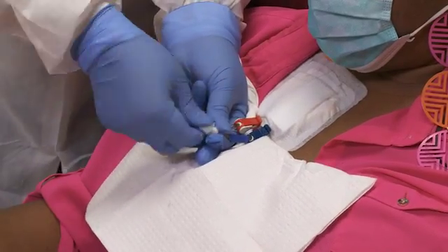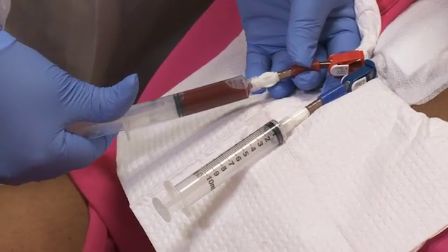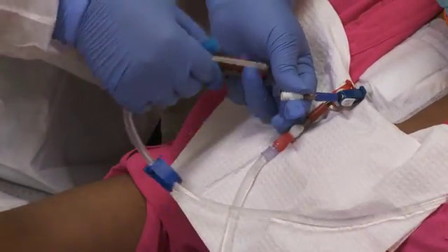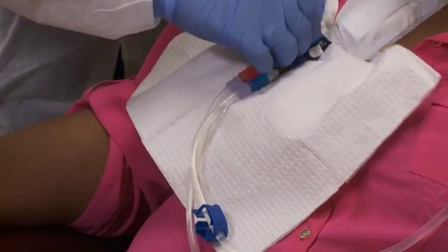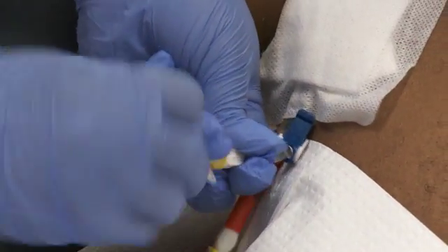To maintain aseptic technique, let the catheter limbs and hubs air dry naturally. Do not touch the cleaned hubs and do not set the hubs down. Connect the catheter to the bloodlines using aseptic technique. Unclamp the catheter only after it's connected, and remove your gloves and perform hand hygiene. If any of your patients use a needleless connector device on their catheter, you should follow the manufacturer's recommendations for that type of device. When the patient has completed treatment, the same care should be taken using the scrub-the-hub procedure for catheter disconnection.